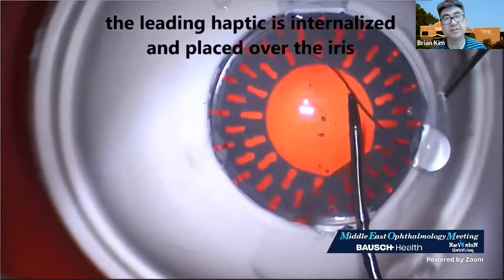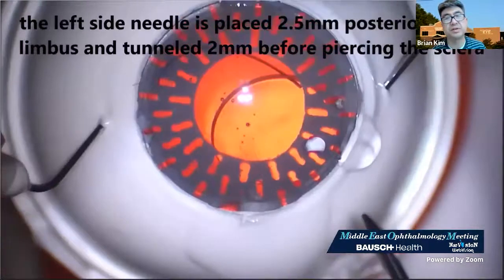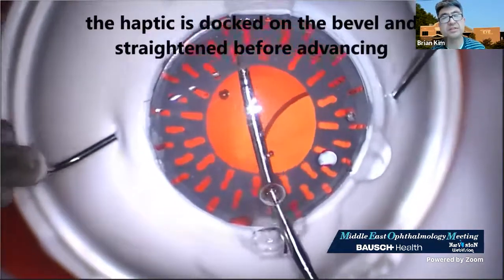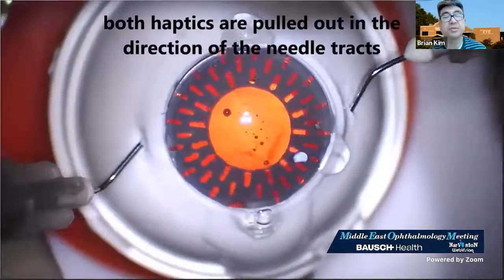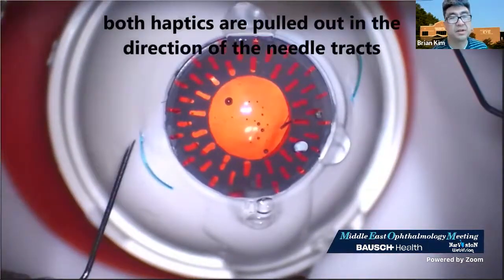And then the leading haptic is internalized over the iris. The left side needle is placed 2.5 millimeters posterior to the limbus, tunneled 2 millimeters. The haptic is docked on the bevel, straightened and flattened. You can see even though I was grasping the haptic somewhat more proximal, I was able to flatten it out and thread the haptic into the needle.